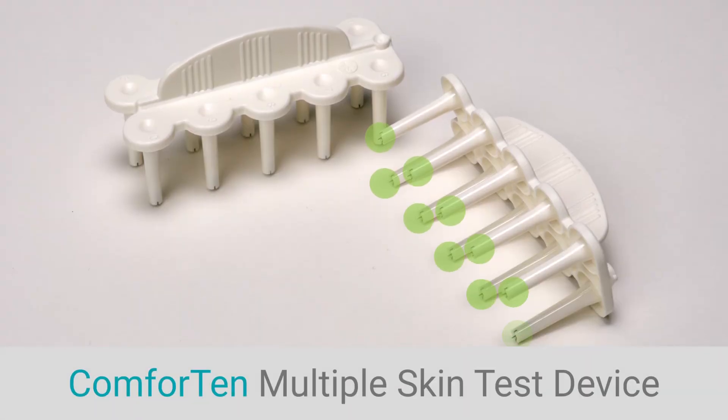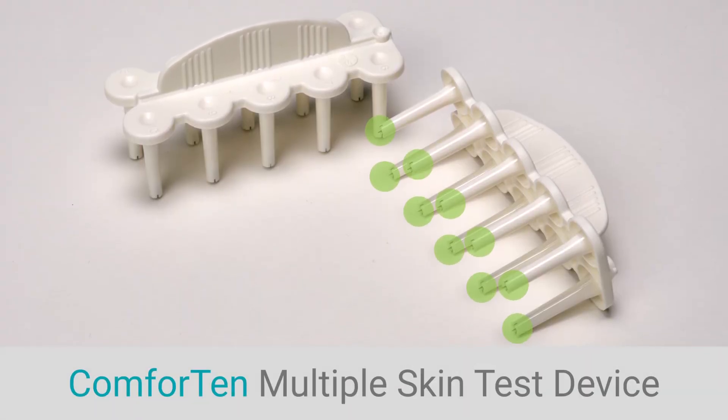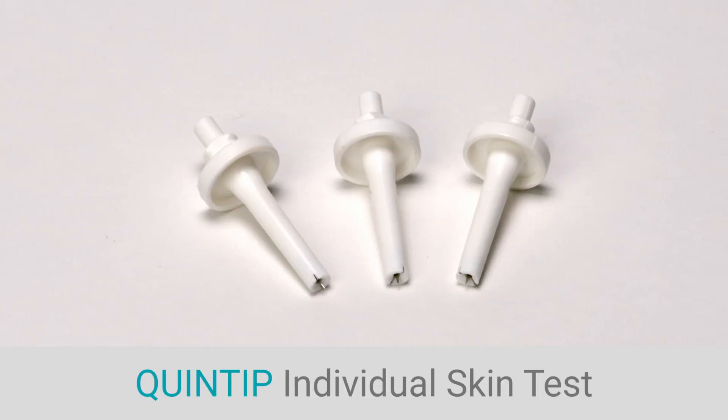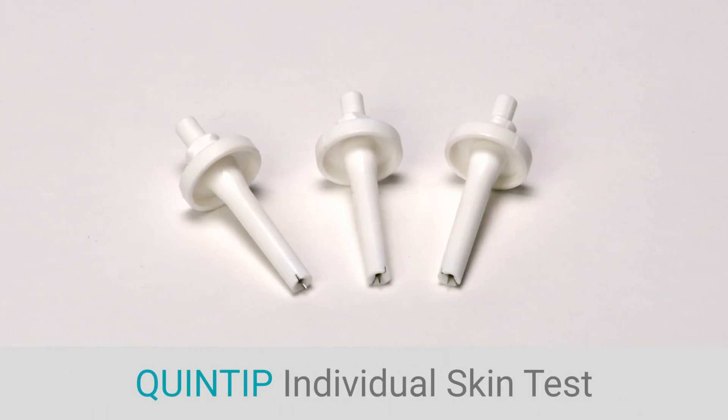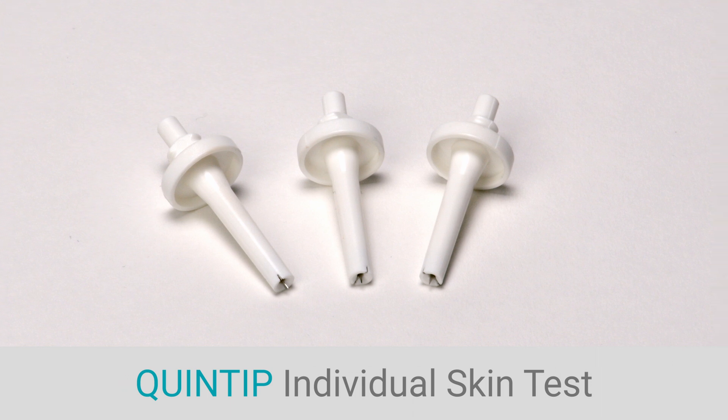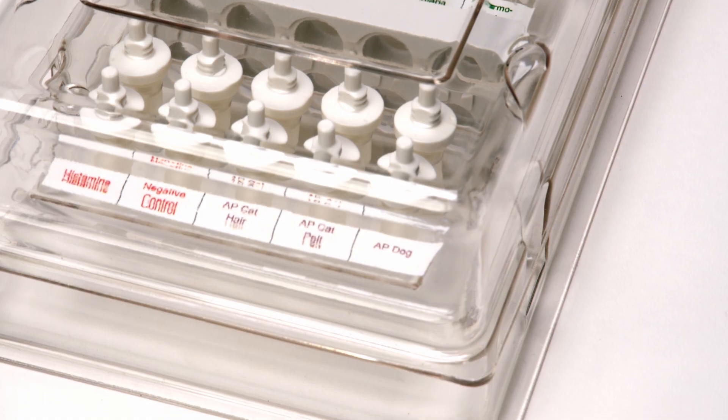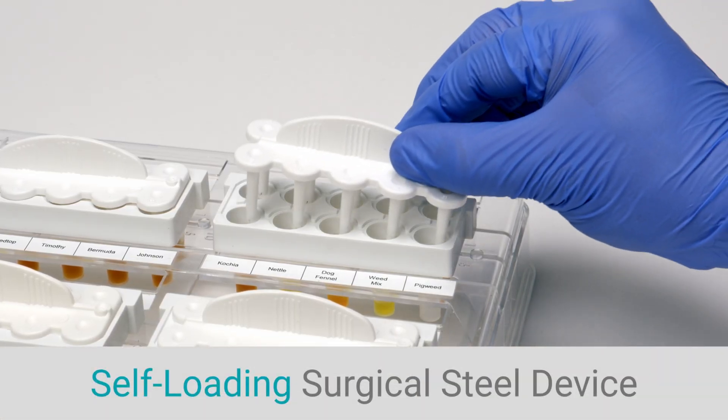The Comforten multiple skin test device applies 10 tests quickly and precisely. Quintip is an individual skin test device and is ideal for testing antigens not included in your normal panel. Both Comforten and Quintip are the only self-loading surgical steel tipped skin test devices on the market.